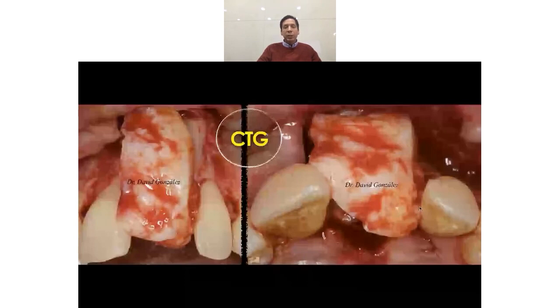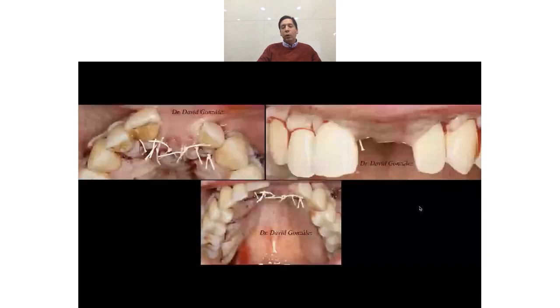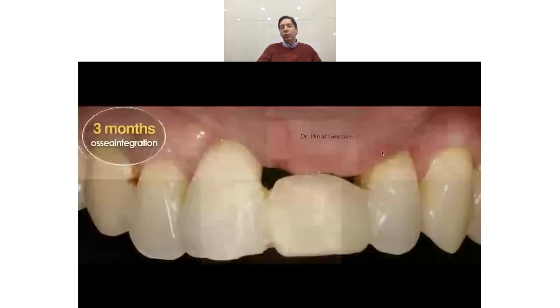I use this big CTG because I want to improve the biotype. I want to have a better emergence profile. I leave it all submerged. And we can see here that the lip is always almost in contact with the crowns.